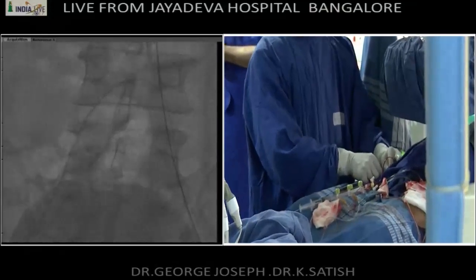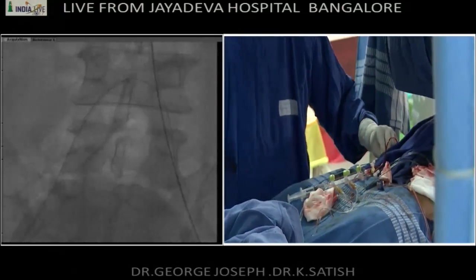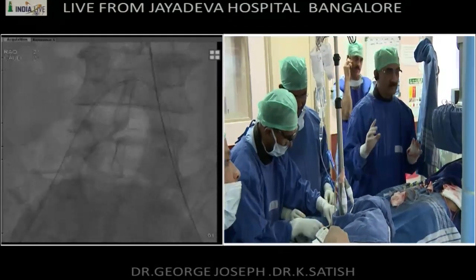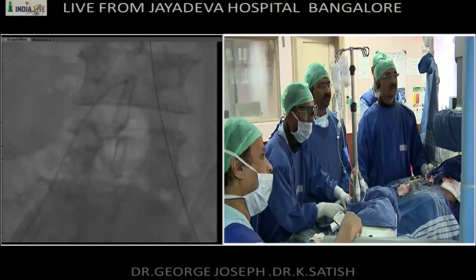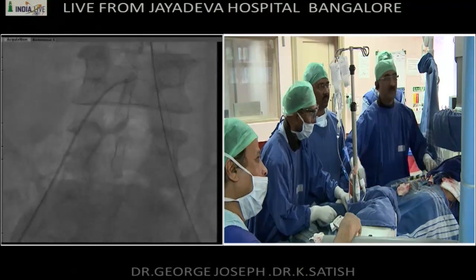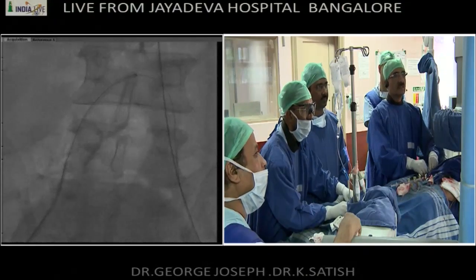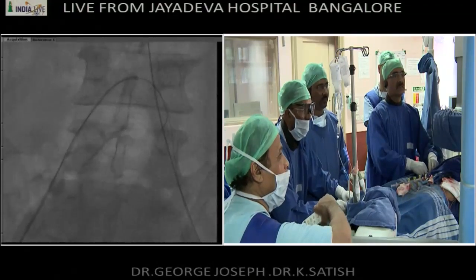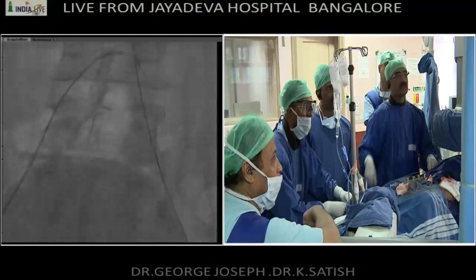All right, so here this has come there. No, not yet. We need to pass the parallel wire. See, we shouldn't lose the wire loop till we get two wires up there. All right, so here it comes. This is going subintimal. I have to go into the true lumen on the other side. Now I think it's gone into the true lumen on the other side. We'll try to redirect it upwards.